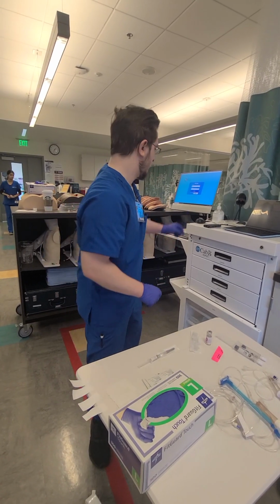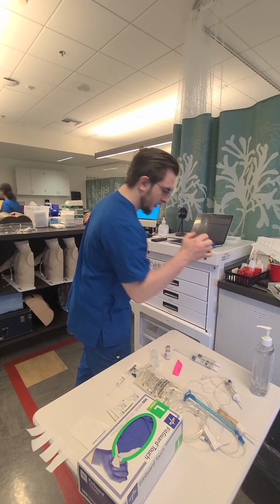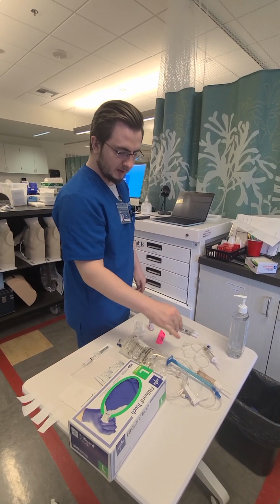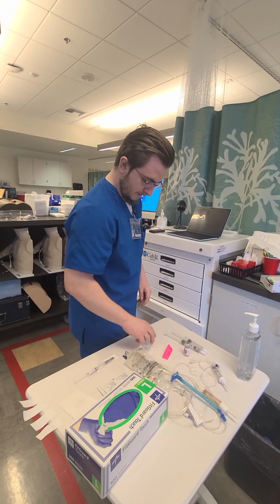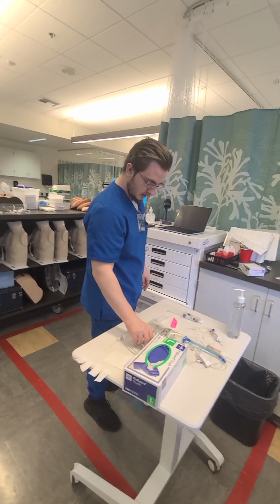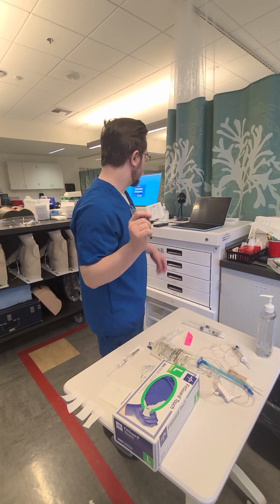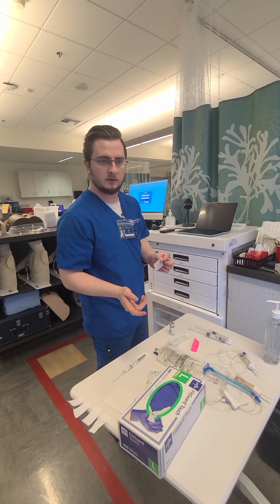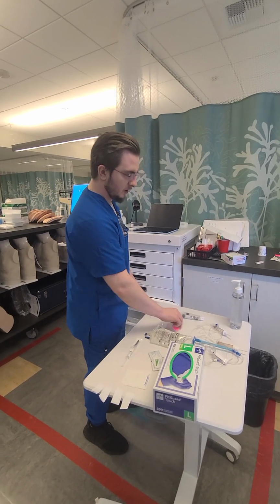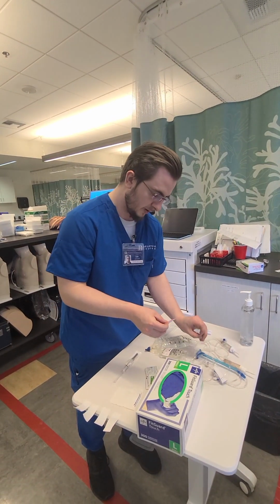Okay, got my Zofran. I have my other medication. I'll log out of the MAR here. And then I'll make sure to get all my other things that I need. My 2 10 mL flushes for my IV push, secondary and primary tubing. I forgot to do it, but I would wipe off the top of the medication for 30 seconds before, and I would make sure to do it when I'm actually giving the medication. And then also, before I go into the room, I have a tag to change out the tubing for my primary. I'll just put it on there now, that way I don't forget.